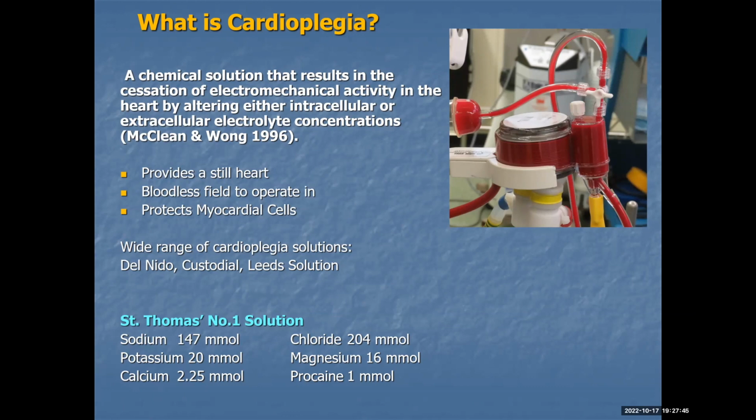If we put a cross clamp on at this stage and we arrest the heart, it will also protect the heart. So we stop the heart, it reduces the metabolic demand of the heart cells by about 80%. We then give cardioplegia with oxygenated blood, and that gives about another 5-10% of the native oxygen demand in that blood.